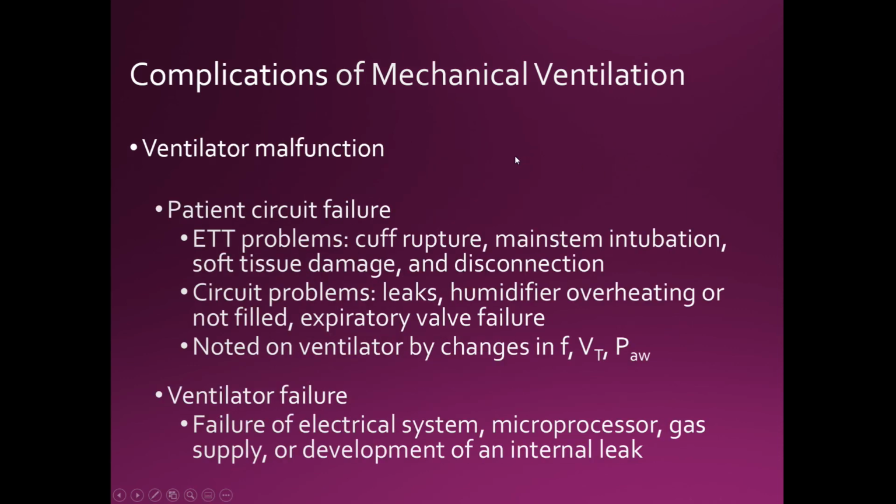So you might have some complications. You might have a complication in terms of the ventilator. If you have a ventilator malfunction, I said either in this lecture or last lecture, chapter 45, if you have issues with the ventilator, don't try to mess with it while your coworker's bagging the patient. Just swap out the vent and figure it out later.